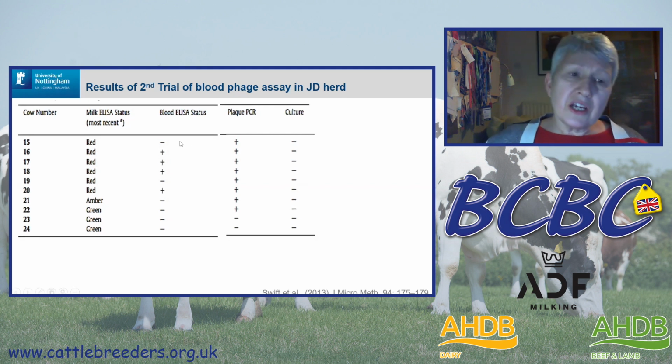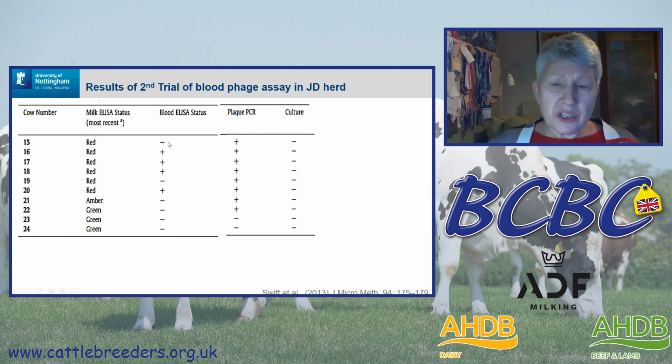Now, on this occasion, what we had were animals that had been stratified according to their ELISA score. So the red animals had the highest. Green is obviously a negative test result, and amber were near the cutoff. So they're in that middle. We only had one of those in this set of animals.